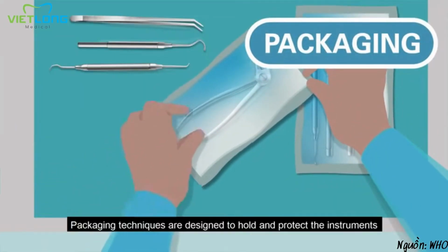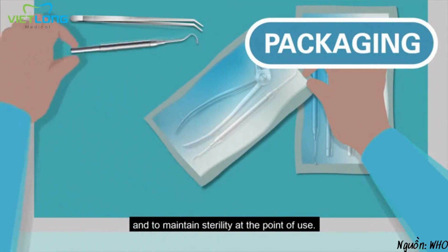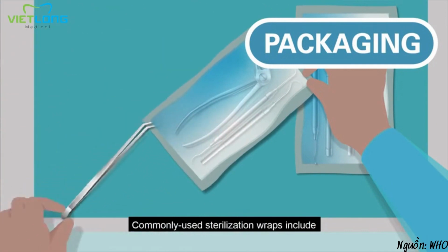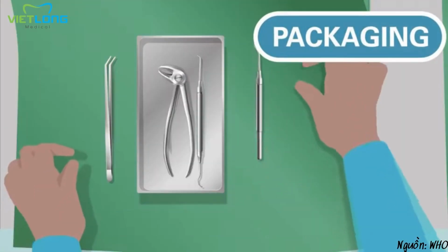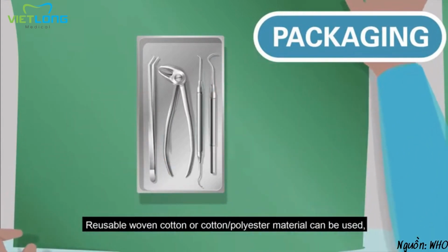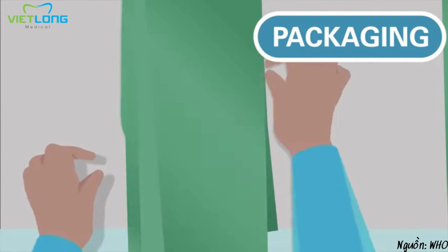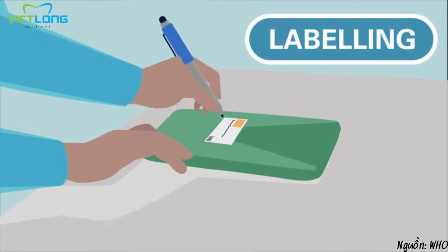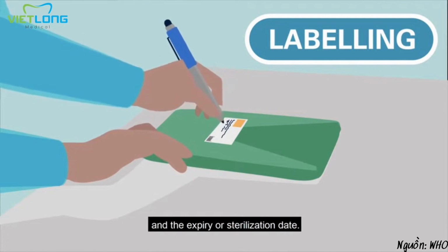Packaging techniques are designed to hold and protect the instruments in order to facilitate sterilization and to maintain sterility at the point of use. Commonly used sterilization wraps include single-use bleached crepe paper and wraps combining cellulose and synthetic fibers. Reusable woven cotton or cotton polyester material can be used, but they are less resistant as a bacterial barrier than sterilization wraps. Packages to be sterilized should be labeled before sterilization. This information on the label should include the name of the instruments and the expiry or sterilization date.